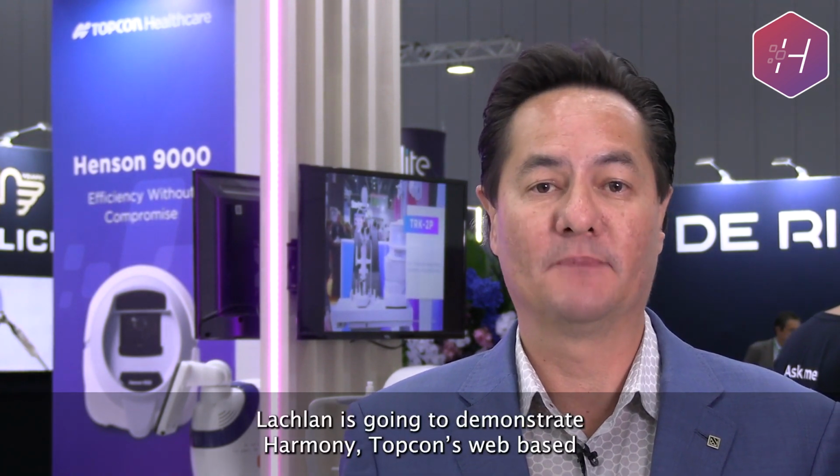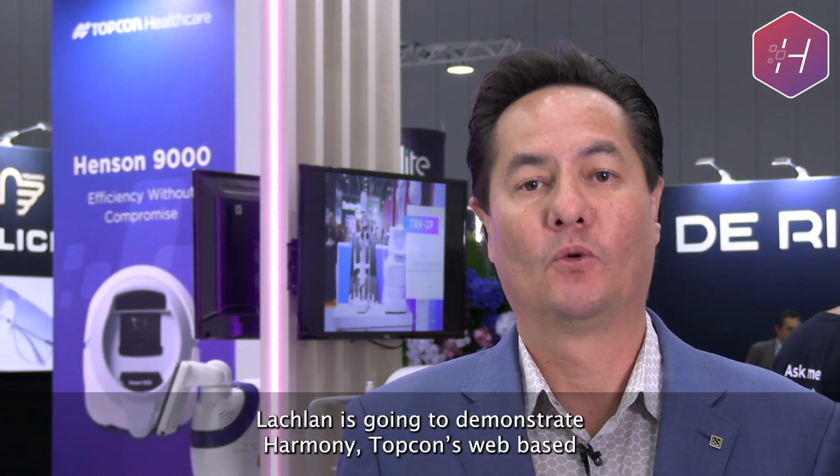Welcome to Omega 23. We're here today with Topcon Healthcare, and we're fortunate to be meeting with Lachlan Wheeler, the Regional Product Lead for Software Solutions in the APAC regions. Lachlan is going to demonstrate Harmony, Topcon's web-based data management solution.